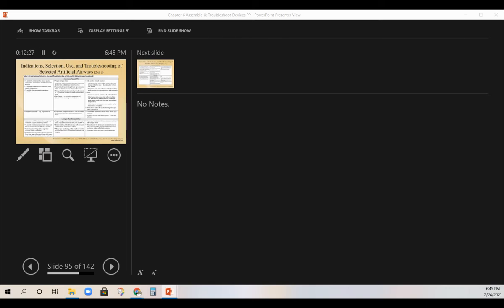So an endotracheal tube shouldn't really have to go into that. We're 19 to 21 for females at our incisors, 21 to 23 for males. Always check tracheal insertion by breath sounds, plus a CO2 analysis, to confirm the proper position with an x-ray.